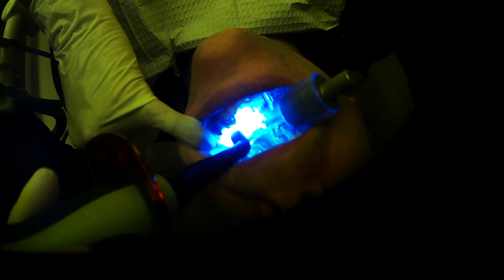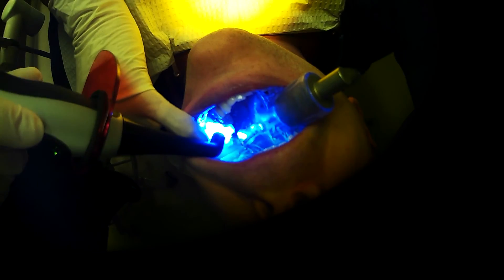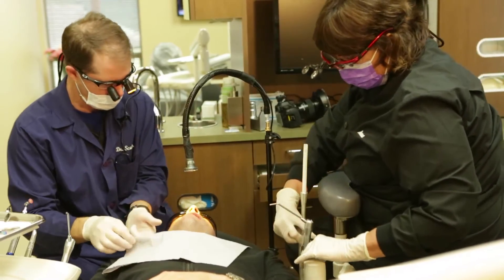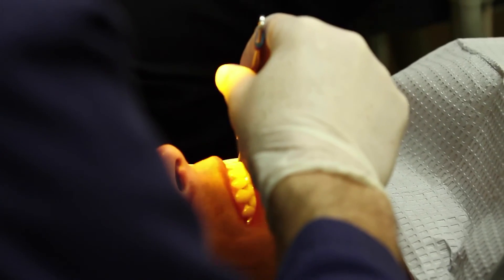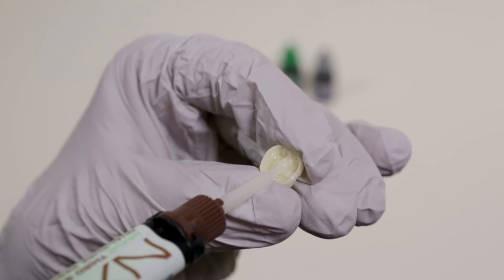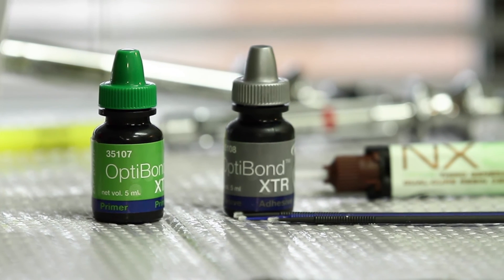This is the brand new Kerr curing light — it is very powerful. If you're using an older curing light, it'd be wise to have it measured and see how strong it is. We want to check our occlusal contacts after we seat the crown — open and lightly bite down, slide with really exaggerating movements to the right and left. Kerr figured out the gel phase exactly right; it doesn't adhere to the adjacent tooth. The bonding process is the most difficult, most technique-sensitive, and most critical to the success of the crown. With NX3, we're not as anxious about it — it's lowered our stress level.